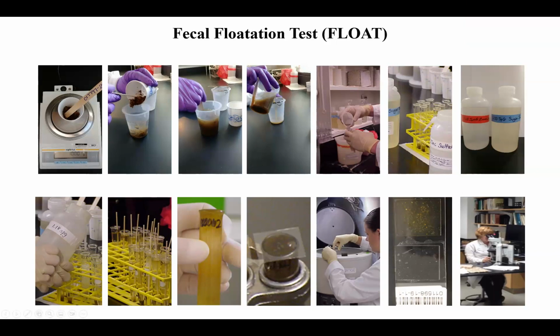Dr. Lejeune, one thing I wanted to point out is that you're requiring at least 10 grams of feces for this sample. For people who are used to doing their own fecals and only using 2 or 3 or 4 grams, they need to realize that because you're using 2 different solutions, you need a larger sample than what they're used to taking.